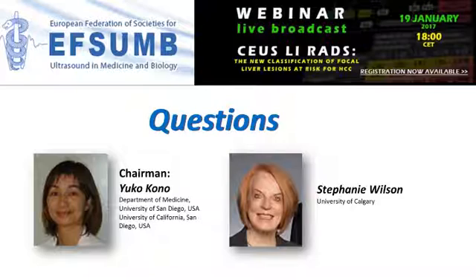There is quite a steep learning curve. The studies are never easy, and cirrhotic livers are in fact one of the more difficult areas for CEUS. People who are dedicated to the performance of CEUS will do better than the casual performer.